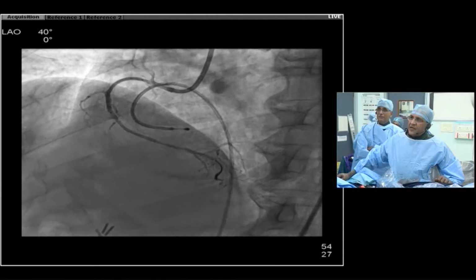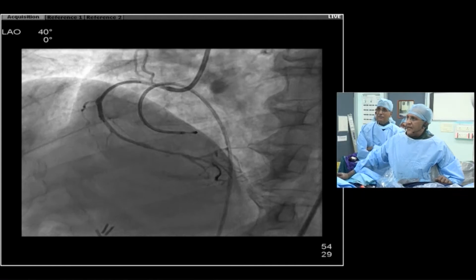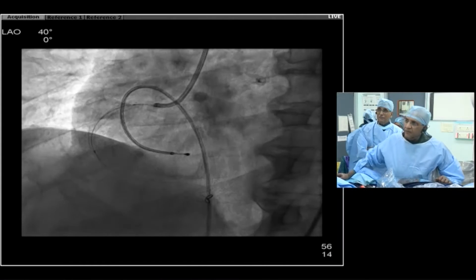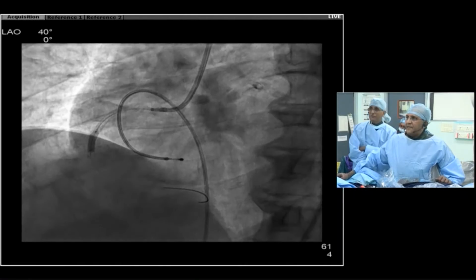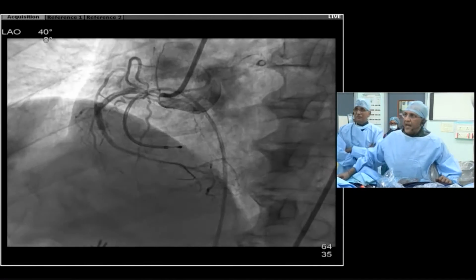Can you see that's the 38 millimeter stent coming in? We withdrew the Guidezilla next, and then deployed it. Next, we took a 3.0 NC balloon, and we went up and targeted inflation. So once we did that, we did an IVUS, and this was our final result.